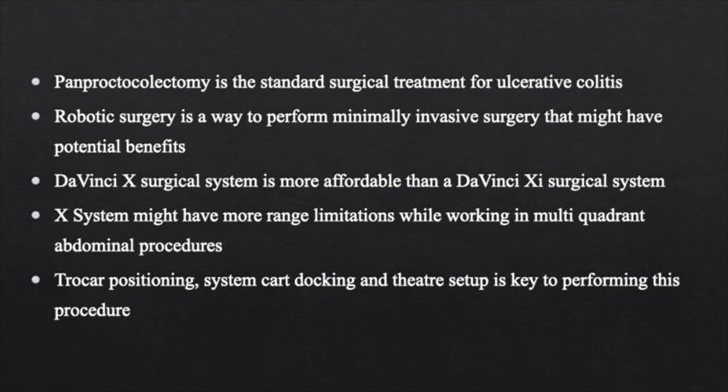Trocar positioning, system cart docking, and theatre setup are key to performing this procedure with an X-System in a safe and effective way.